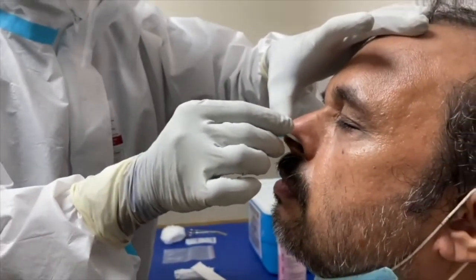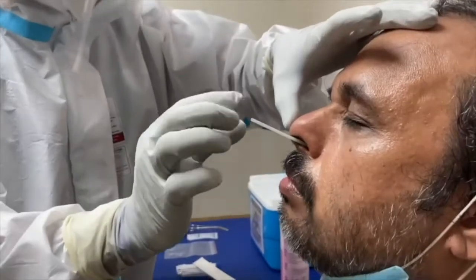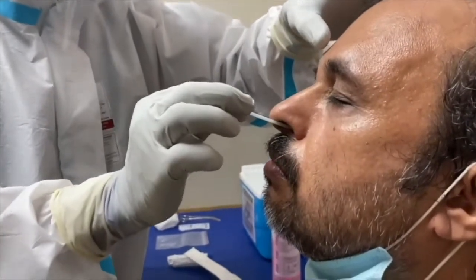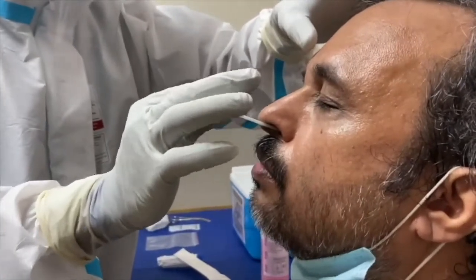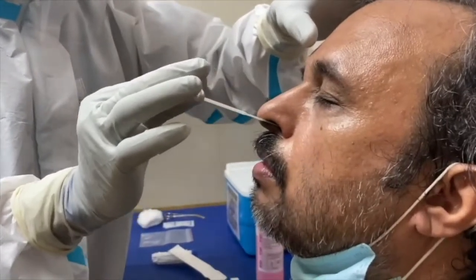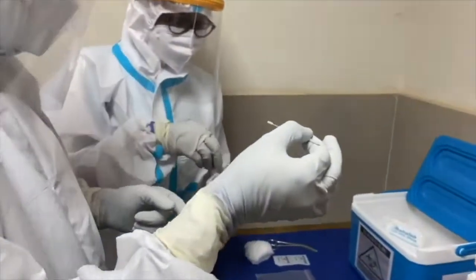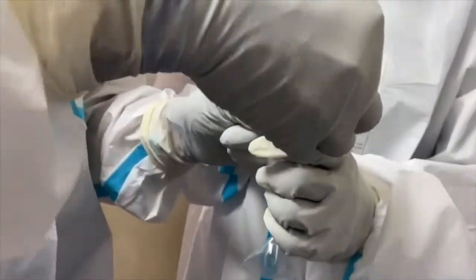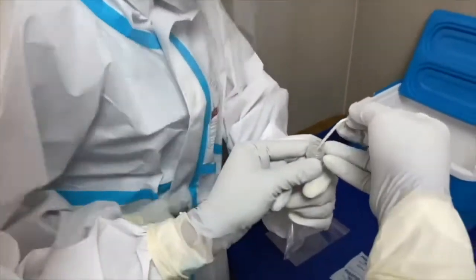The nasopharyngeal swab is inserted through the wider nasal cavity and is stopped when you feel resistance at the posterior nasopharyngeal wall. It is kept in place for a few seconds, rotated 5 times, then removed gently and transferred to the viral transport media.